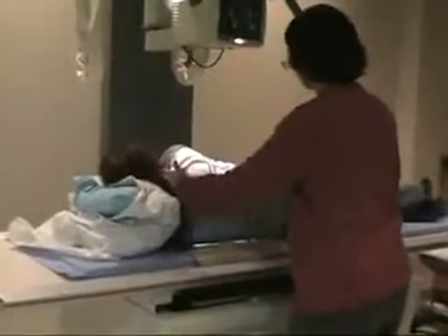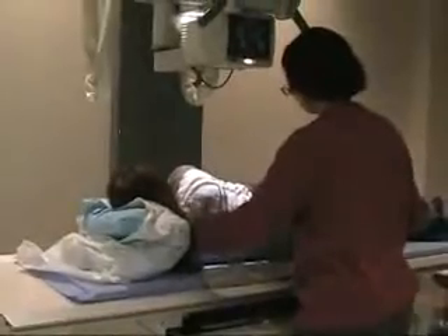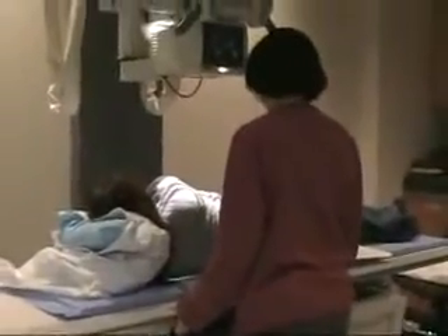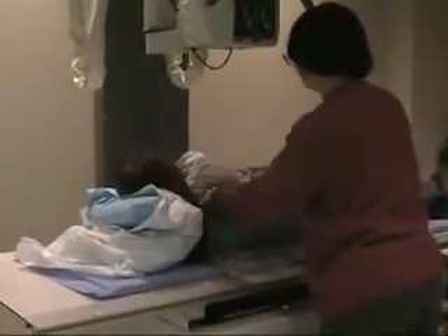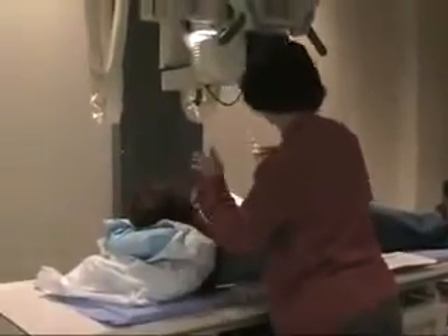It's going to change the neck, but it's not really going to change the thoracic spine too much. So we're still centered. We've still got light behind it, and we're still below the vertebra prominens.